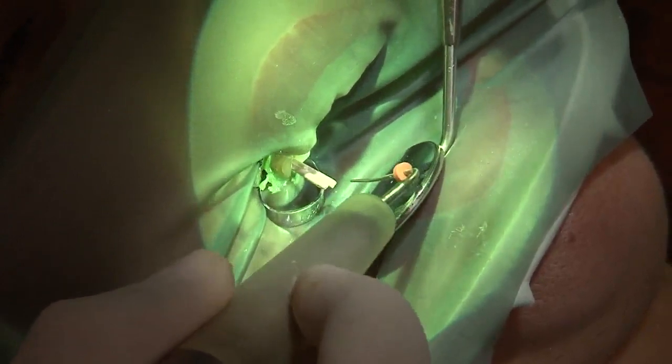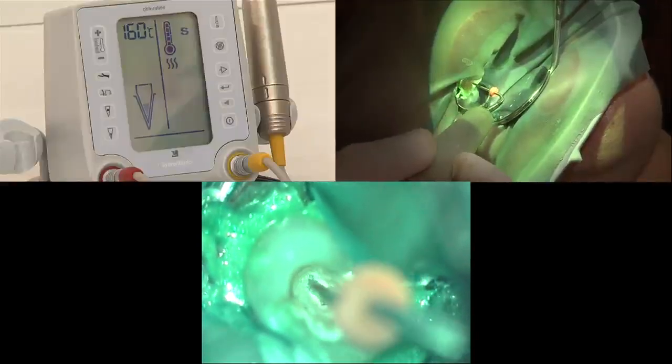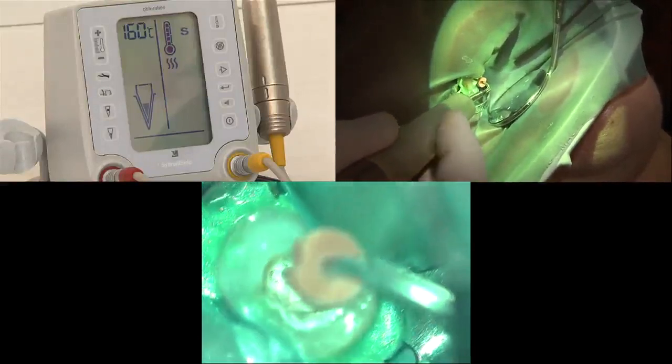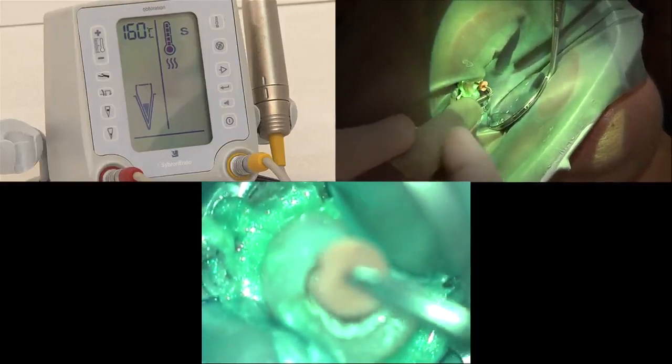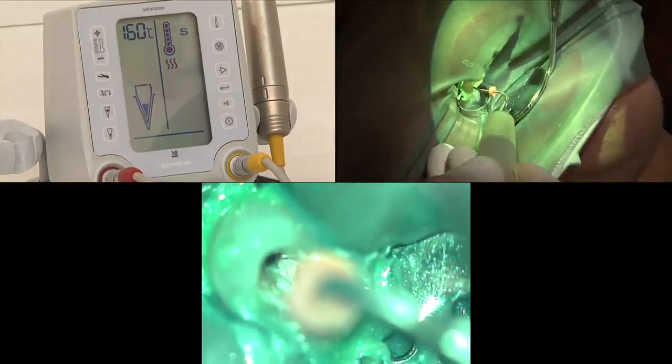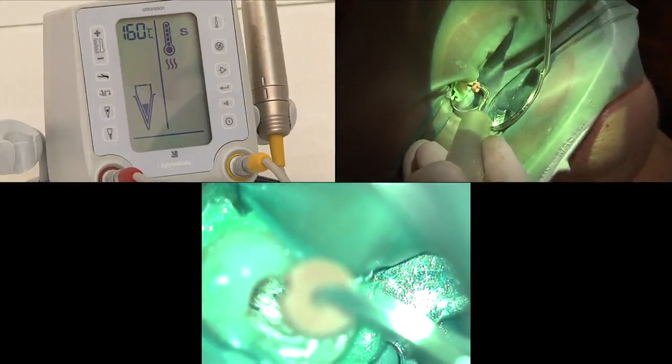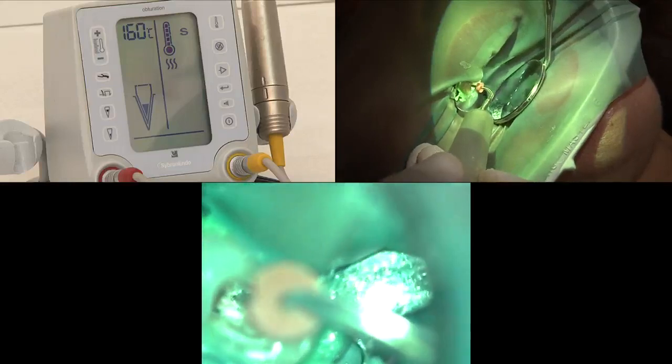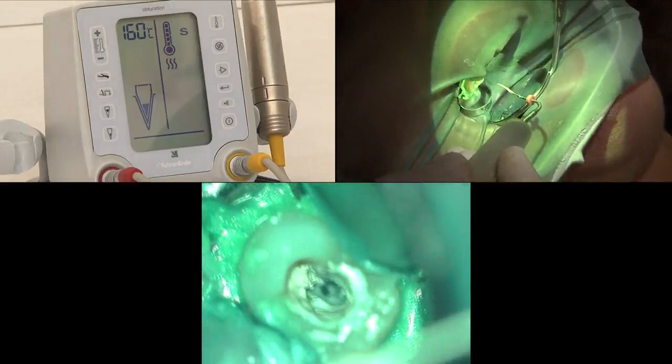160 degrees for the down pack using the System B plugger. At the beginning I cut the master cone at the orifice. I use a hand plugger to seat the orifice in order to create a maximum of hydraulic pressure. Then the System B is pointed in the middle of each canal. The down pack is done in a couple of seconds, two to three seconds. One millimeter prior to the pre-calibrated length, I switch off the power, and I continue until the rubber stop reaches its level. I stop for 10 seconds. The unit will give me a small beep beep sound. And then I activate for one second like a thermocut, and I take back my plugger. My down pack is completed. As you can see on the video, all the isthmus are being filled with the obturation material.